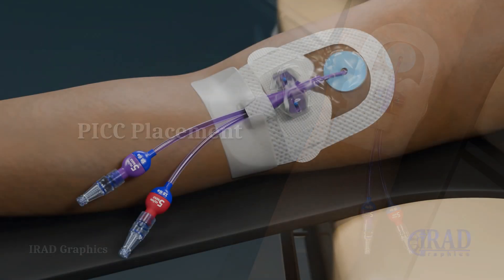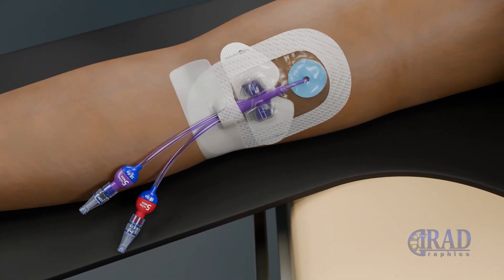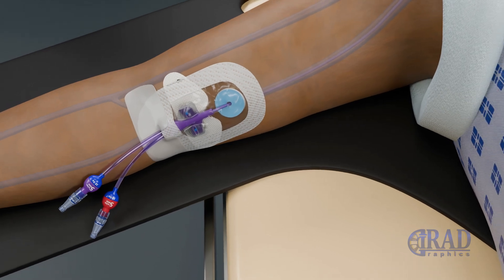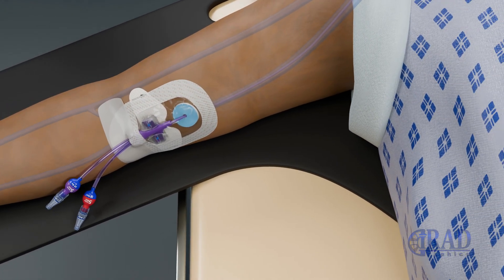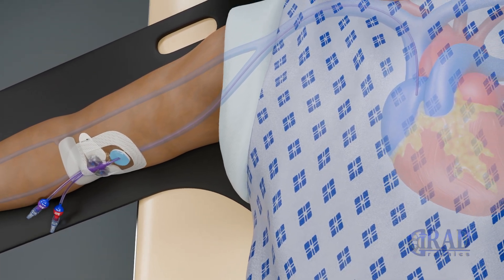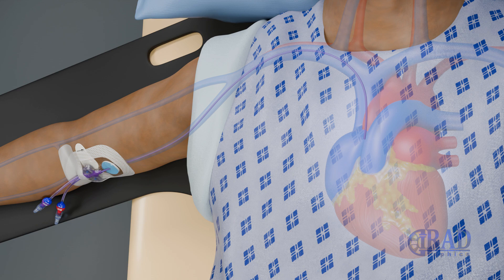A peripherally inserted central catheter, called a PICC line, is a long, flexible catheter placed in a vein in the arm and threaded to a central vein near the heart. This minimally invasive procedure provides long-term intravenous access for patients requiring extended treatments such as chemotherapy, antibiotics, total parenteral nutrition, or frequent blood draws.